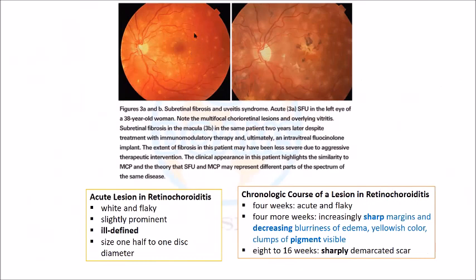There are multiple yellowish areas, right? Okay, Farial, can you see multiple areas in the retina? Yes, sir. Here also multiple areas, but in the central area, the white is becoming thicker and persistent looking, and there is pigmentation. Can you see? There is pigmentation. So again, this is the initial stage of the choroiditis or chorioretinitis. This is the later stage of chorioretinitis.